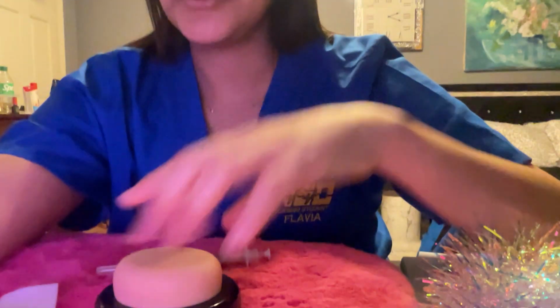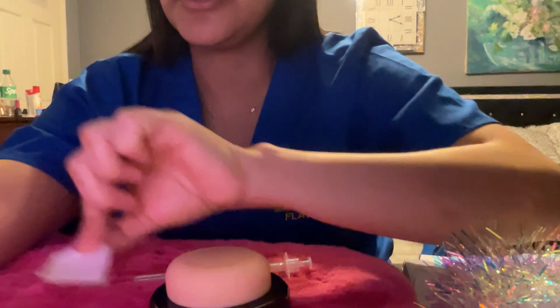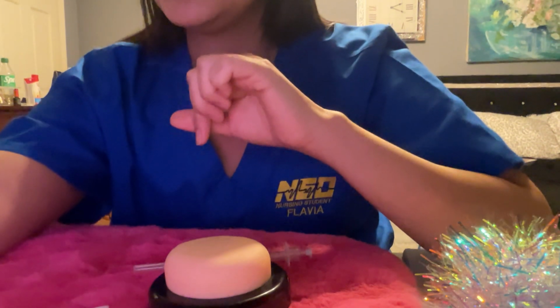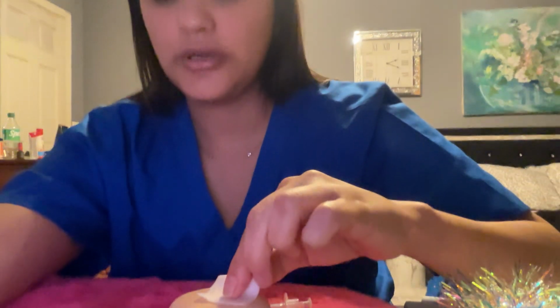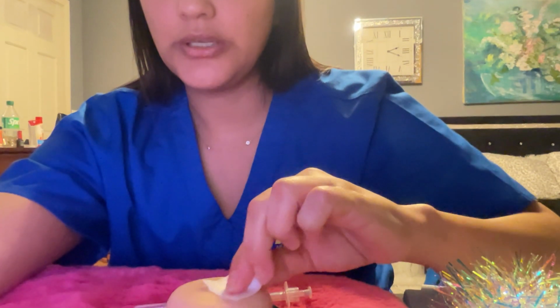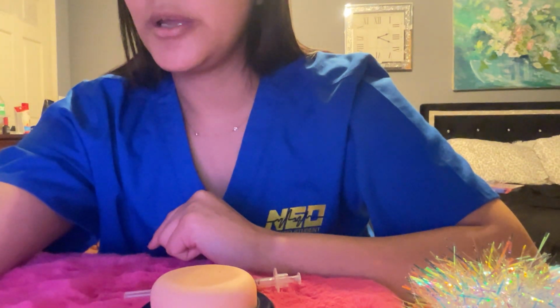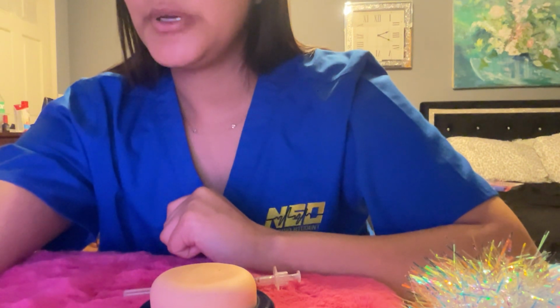Okay, so the next thing you want to do is find the injection site. So you have your skin, and you don't forget your alcohol. Then you apply the swab to the center, in a circular motion outward. Okay, and then you allow it to dry.